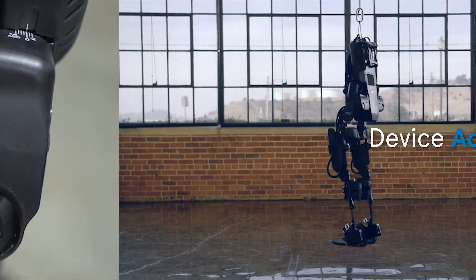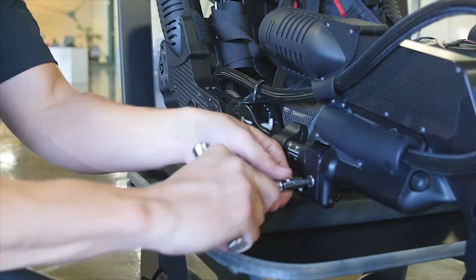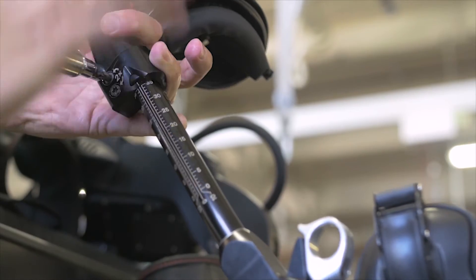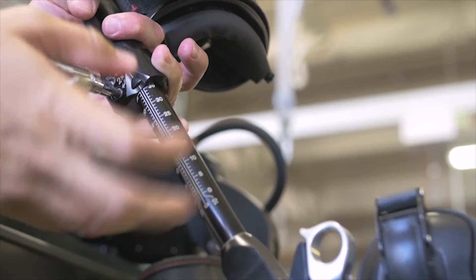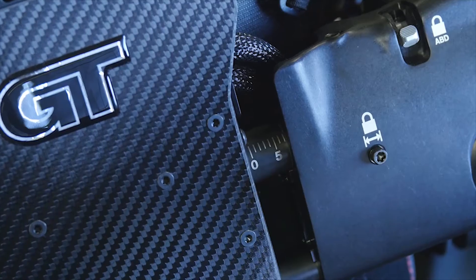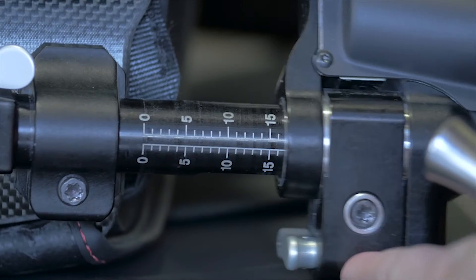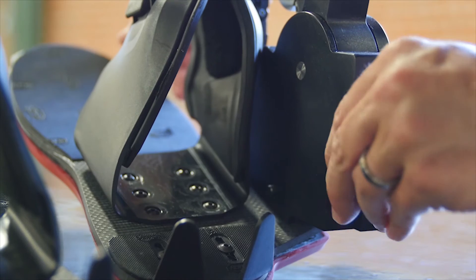Device adjustment requires two wrenches and is about a five-minute process to adjust for each patient. It was designed to be used by many patients throughout the clinical day. The adjustments include hip width, hip abduction and adduction, upper leg, and lower leg. The ankle can be adjusted as well, but no wrench is needed.